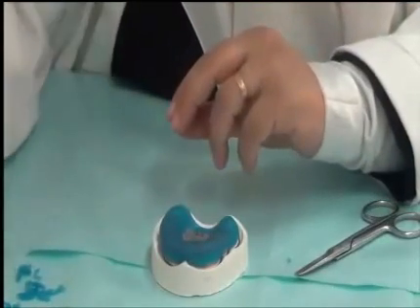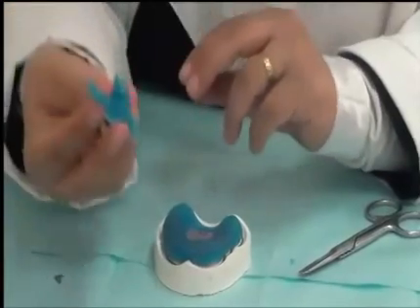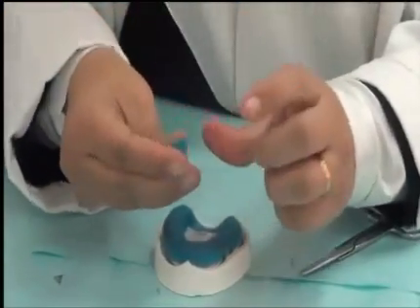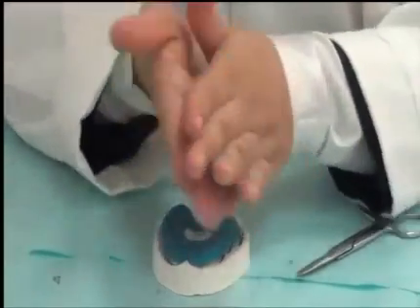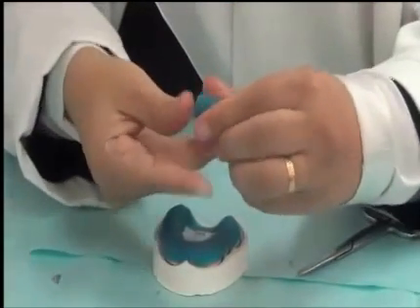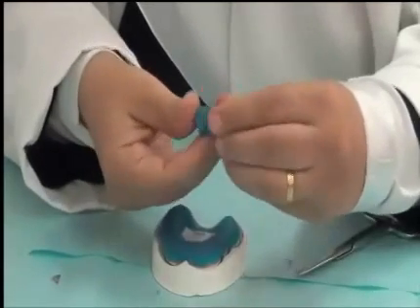For the handle, we can take the excess that we had and mold it into the form of a roll. Okay. We press the excess from one side, so we roll it, and it will have this shape.